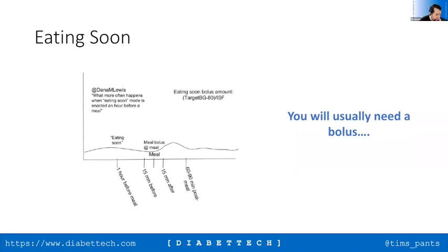Comment about not in 2.8.1, Norman, what's that? Hasn't the download from Nightscout been disabled in 2.8.1? Yes. But for Android APS, you've got automations, and you can automate and then run it from the GUI. So the Nightscout use is more important for OpenAPS users rather than Android APS users at this point in time. So that's Eating Soon, and I find it makes a big difference to what happens to my postprandial glucose levels. Others have mentioned in the chat that they do find it helpful.